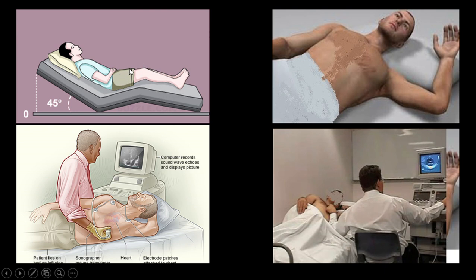And even, if you notice, some patients may be sitting, like in a wheelchair, and it's very hard to take them to the bed, or they cannot lie down on the bed. So we have to scan the patient in a sitting position, or even sometimes standing, and you will notice when you're working. But the most important point is that you know how the relationship of the heart and acoustic window will be in any position.